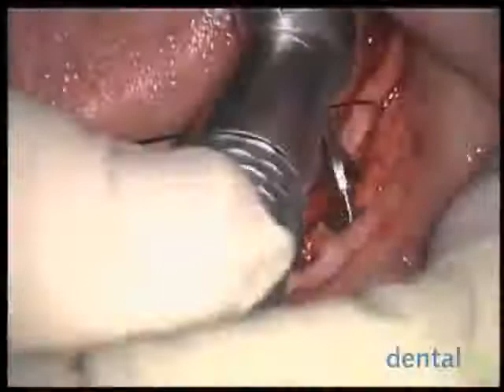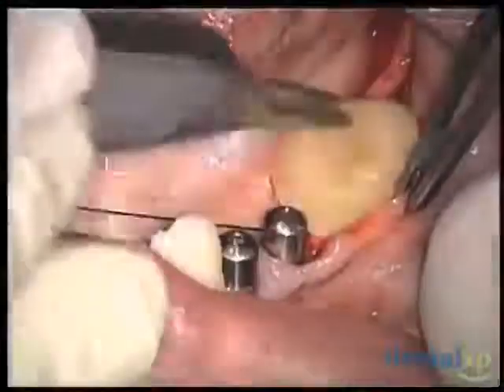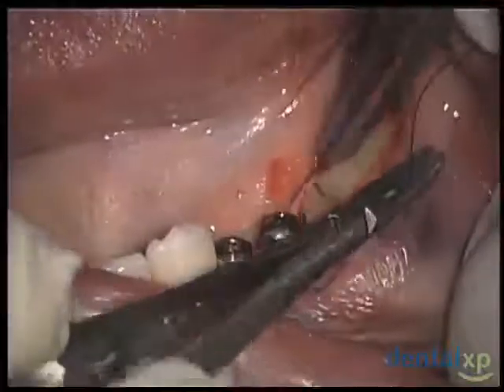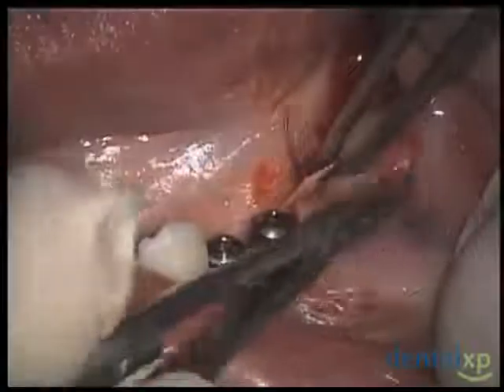The bone that was collected while the osteotomy was performed will then be placed with PRGF, and the area will be sutured and left for the healing period.